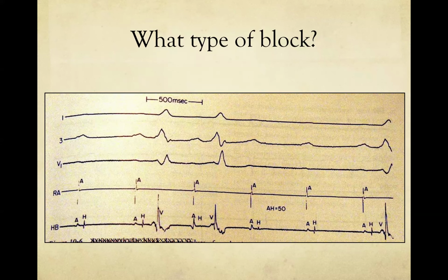So this would be the more common type of thing we would see if we did EP studies, mostly in people who had heart block following surgery, and would be something that would worry us. I'm not saying that this would absolutely equate to you need a pacemaker, but if you were 8 to 10 days out, I think probably I would say this is equivalent to needing a pacemaker. Thank you for clarifying. Thanks.